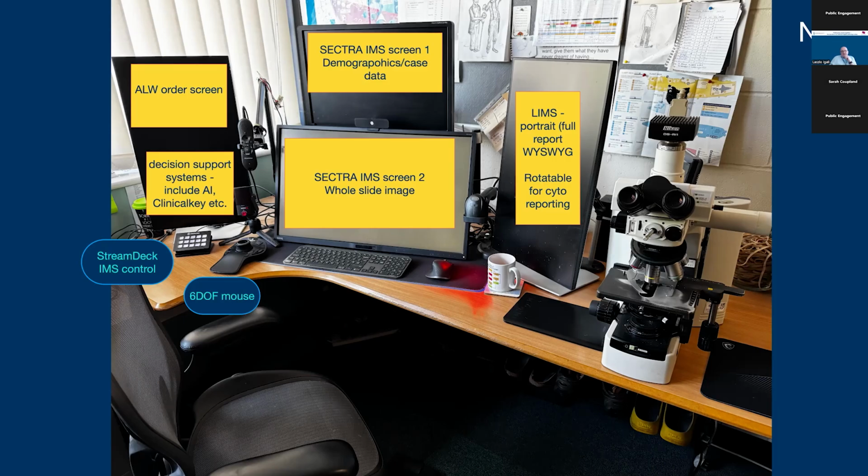When we are looking at the other elements, I still have a conventional mouse, which has this thumb wheel, and I've got a 2D barcode scanner. One stop here for a moment. The current slides, probably in your lab as well, do have two-dimensional barcodes, Data Matrix most of the time. Why it is important: I can scan the form and the slides at the same time, and I'm not missing the numbers, which is my main vice with all of those things.